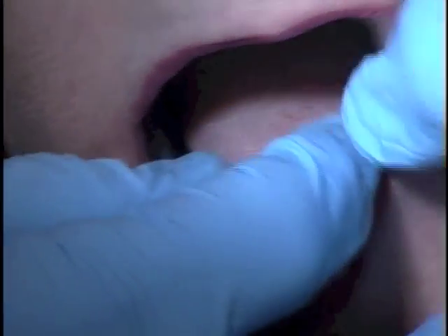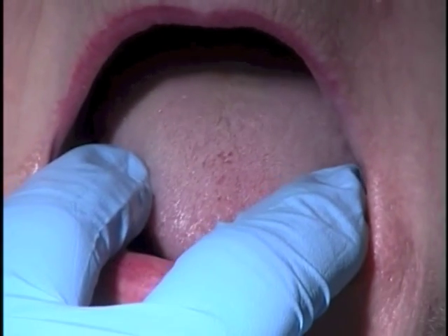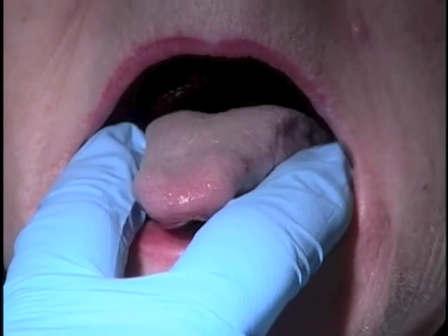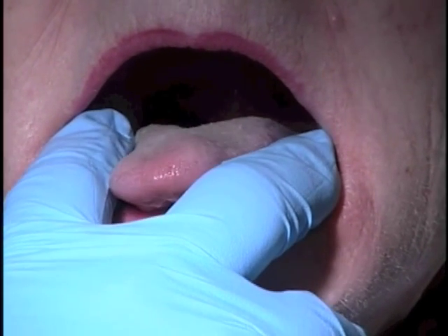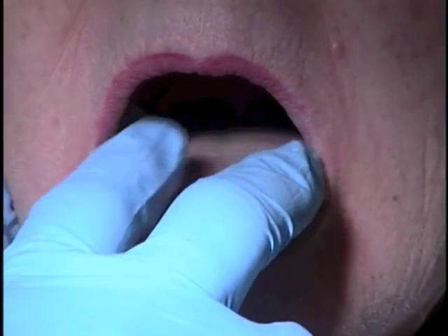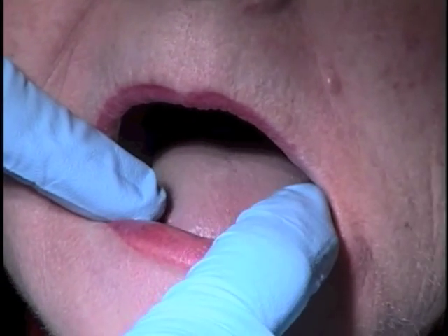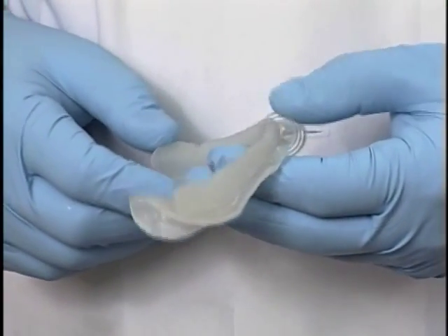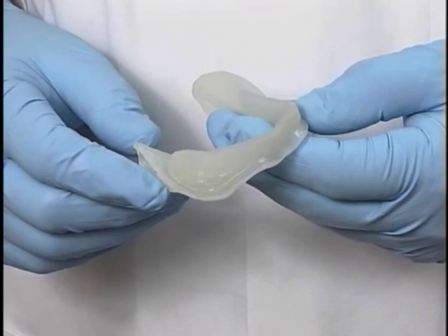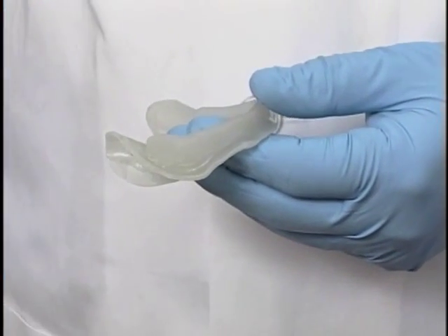As far as the lingual ones are concerned, just set your head back, please. That's done strictly by feel. If you would put your tongue straight out at me, and that feels very stable. It's not moving the tray. So that has to do with the design of the lingual flange, accounting for the anatomy. Now that we've evaluated the length of peripheries, we found that all of the linguals were of adequate length, the length that we would like them.